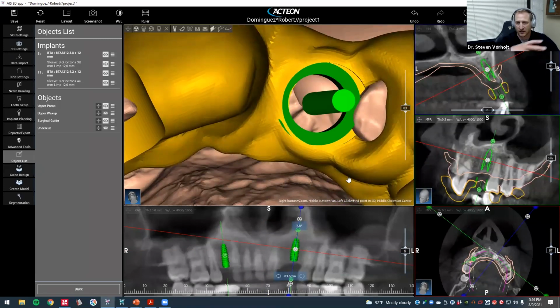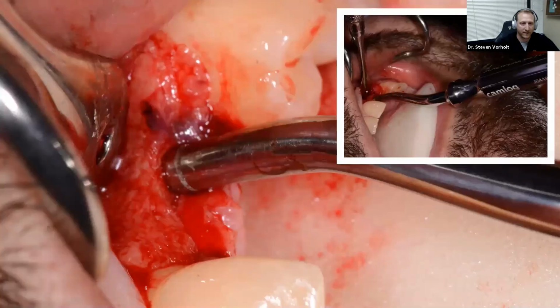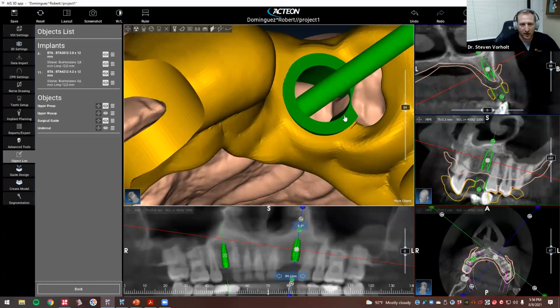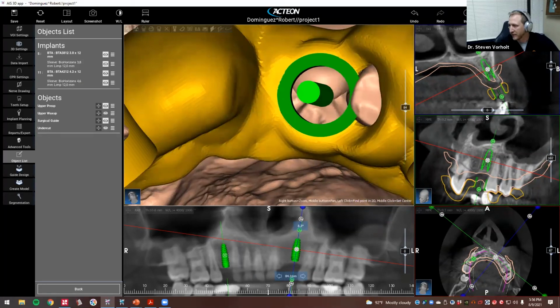We can see in the slides of the actual surgery that it was not impinging. The BioHorizons sleeves do have a flat edge. I actually don't even have it turned in the right direction, but I would position that flat edge intentionally towards where there's more likely to be impingement. Alternatively, you could take a high-speed carbide burr and cut the portion of the guide sleeve that is impinging on number 12. It's very, very close, but I made sure when I was in the software that it wasn't. In the demo, it looks like I got a little bit close, so that would have been impinging. It's something you would have had to know going into surgery, certainly.